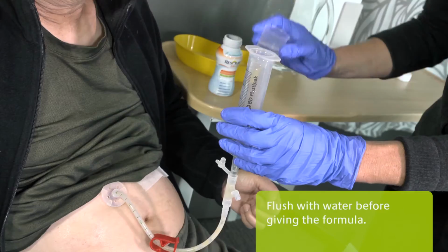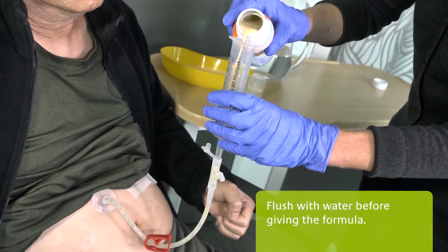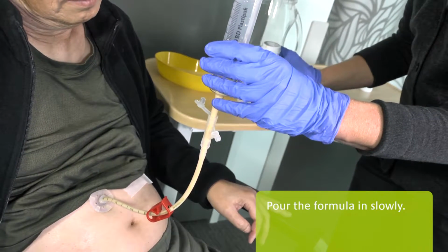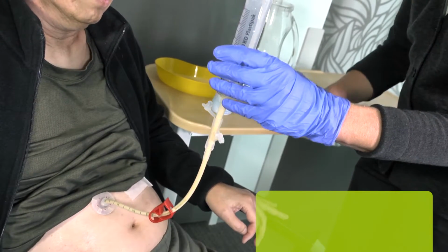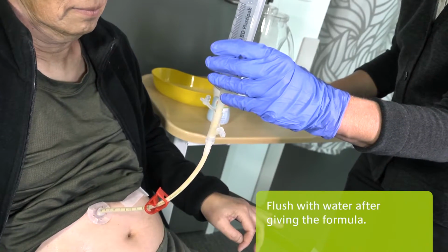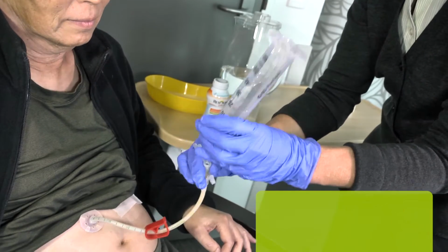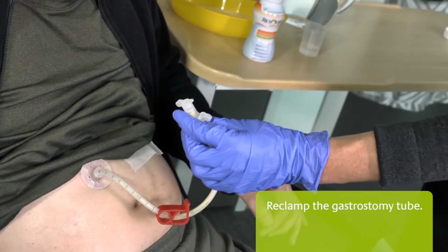Flush with water before giving the formula. Pour the formula in slowly. Flush with water after giving the formula. Remove the syringe. Recap the gastrostomy. Reclamp the gastrostomy tube.